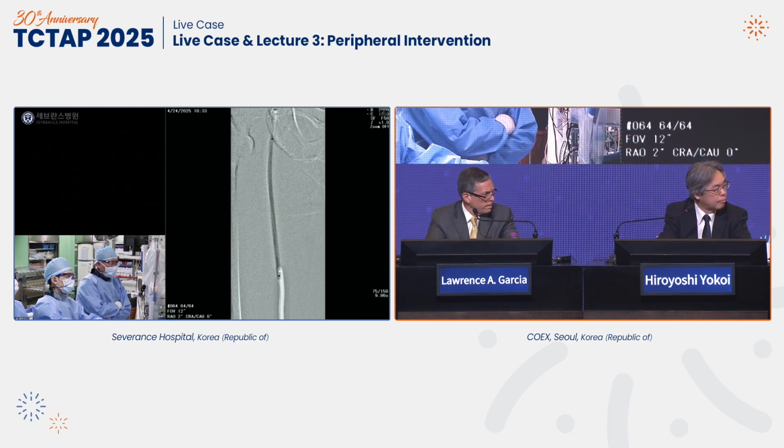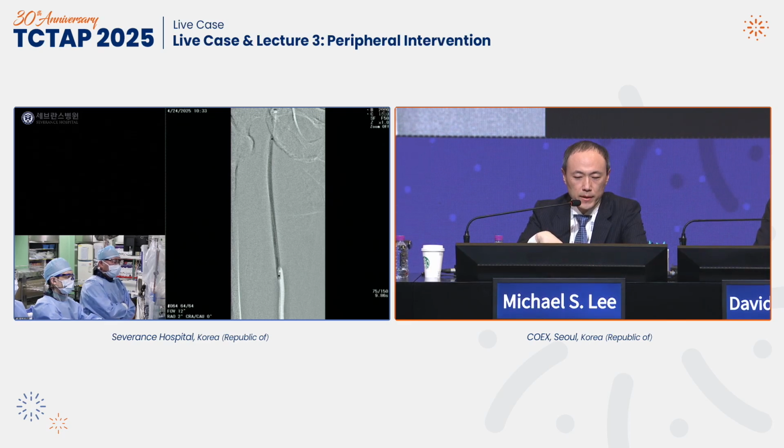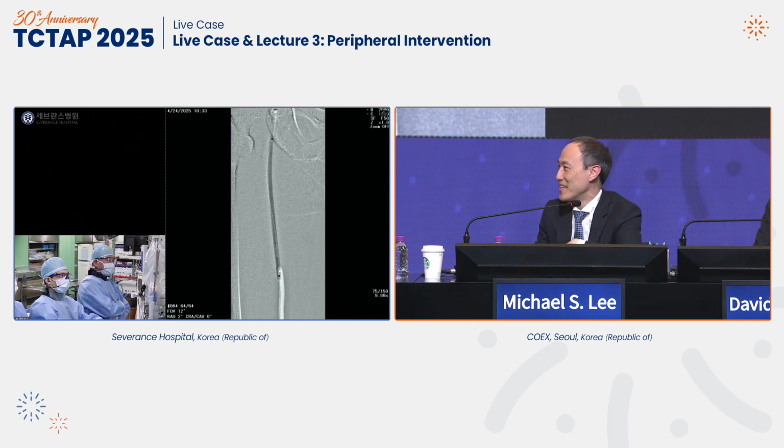Dr. Ko, just from a technique perspective, so you have a sheath in the left CFA? Yes. Okay. This is Viking sheath. Okay. And is the sheath hubbed? Because I see you reach over and put your hands underneath the II, and I'm very particular about that. In such a situation, what I would do is use a long sheath and extend the sheath in the hub, put it on, let's say, the lateral aspect of the SFA. Use Tegaderms to fasten it down, so you're not reaching over. Basically, you're just working almost like using a sheath in the right groin to treat a left SFA. I see. Our facility has lead-coated gloves, but still, reaching over, I'm very particular for me.